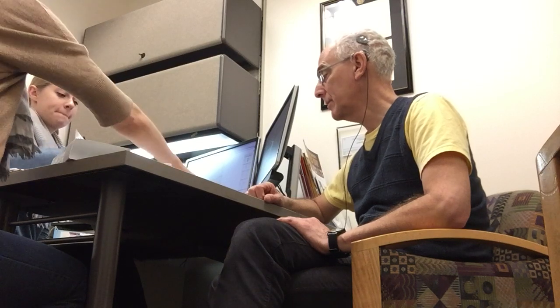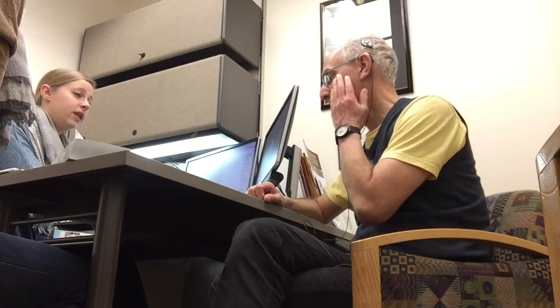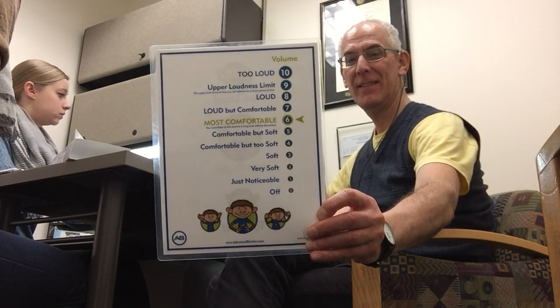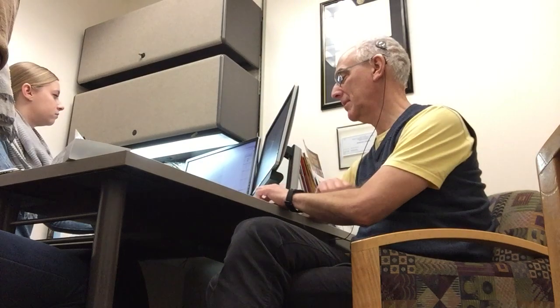I know the arrow's there, so it's confusing. All right. So we want it to be up here. So loud, but still tolerable. Not like you want to take your implant off. Okay. Do you use 2 or 3? I think 3 for him. And then you usually bring it up. Yeah, you can drag it. Why don't you give me the kids side? This one's more fun.